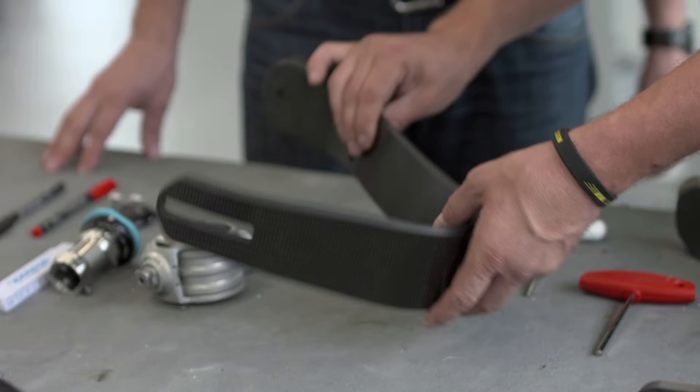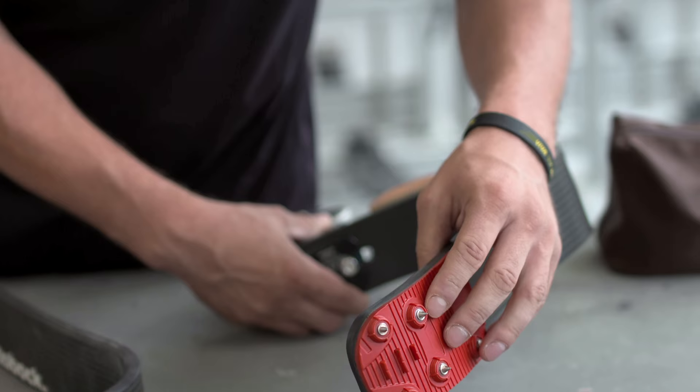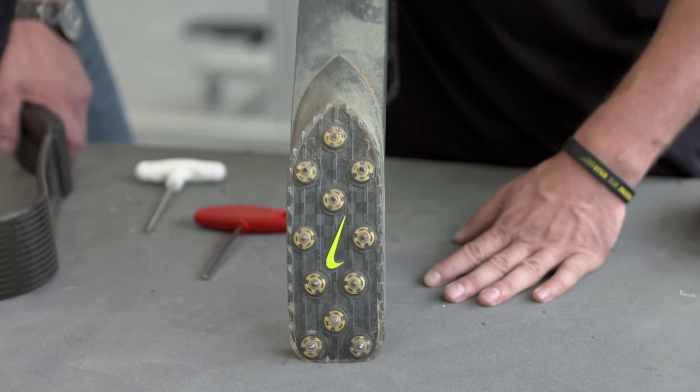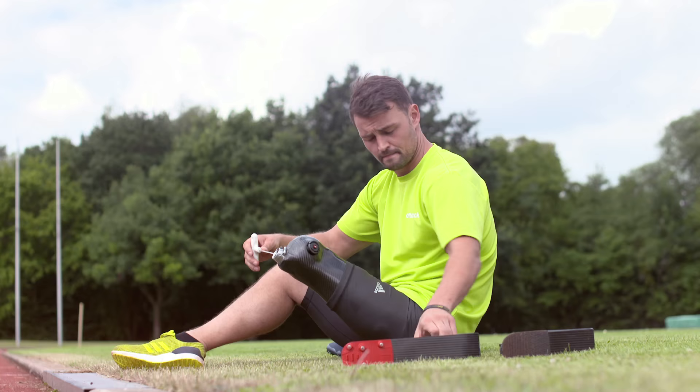Here on the table we can see all the parts needed for competition through the Paralympic Games — three feet for three different competitions. This foot is used during warm-up. Then coming into the stadium, you need a spike plate, and for the long jump you need a bigger spike plate because sometimes it's slippery on the board and you need a good takeoff.